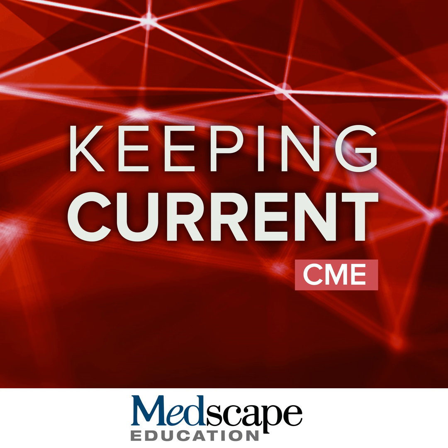So here is a summary of those imaging workflows for the 3 patient scenarios. And the final point that I'll mention is that in the case of moderate or severe ARIA, closed loop communication is warranted, as those findings will affect a patient's eligibility for continued drug dosing. Next, we will move on to a few cases.